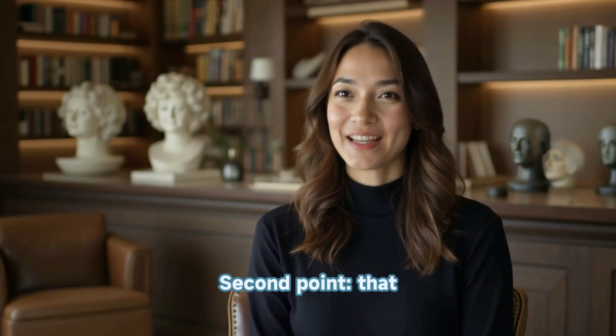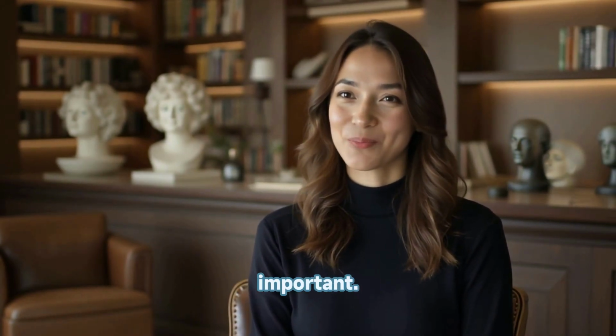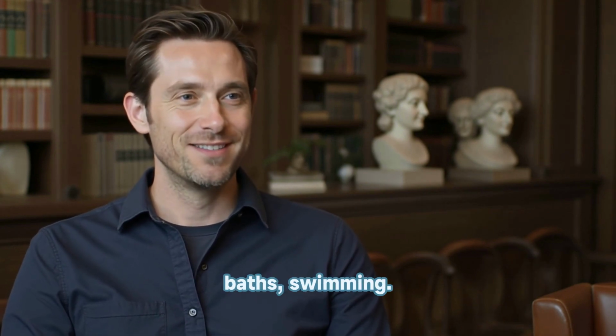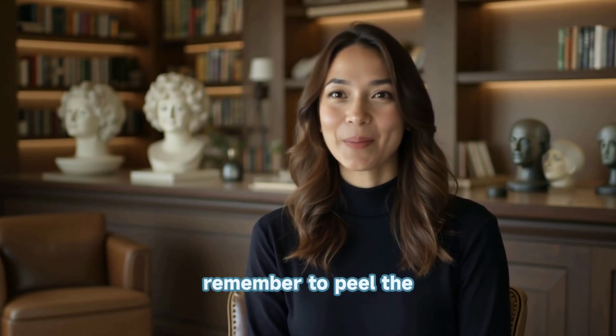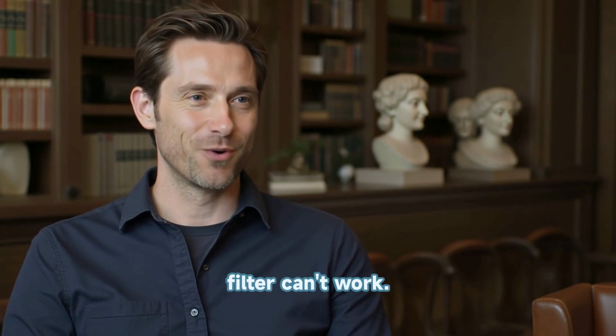Yeah. Second point. That little sticker that often comes with it, it's not just spare packaging, it's important. Use it to cover the filter during water activities, showers, baths, swimming. Mm-hmm. But third, and maybe most importantly, remember to peel the sticker off afterwards once the bag is dry. Don't leave it on permanently or the filter can't work.